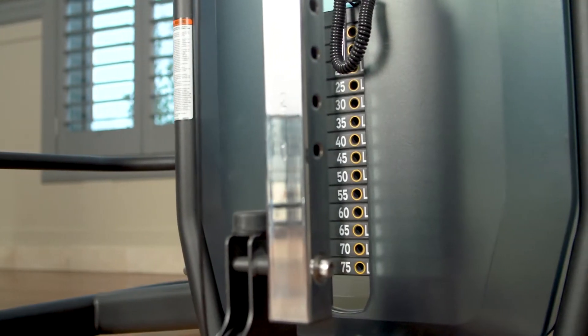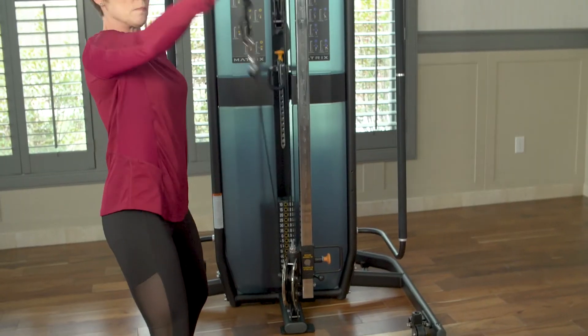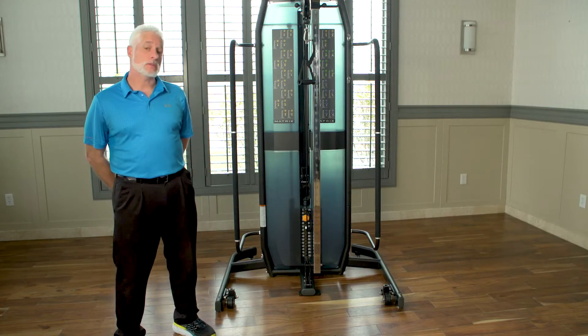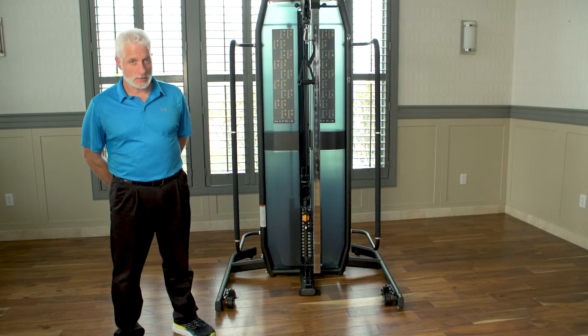I encourage you to look into this adjustable pulley system. I believe that you will like it and you'll gain a lot of benefit from it as well. And of course, in the physical therapy world, it's measurable, it's payable, and it's billable.